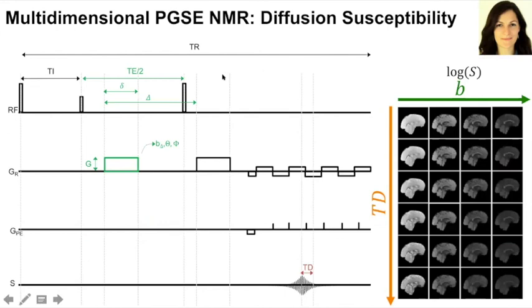This was also presented at ISMRM last year. What we did is we introduced this extra parameter TD, the delay time. This is based on the asymmetric spin echo sequence, where you delay the readout and you become sensitive to these susceptibility effects. And we try to estimate the frequency difference that arises between the signal in the intra- and the extra-axonal space, according to this hollow cylinder model.